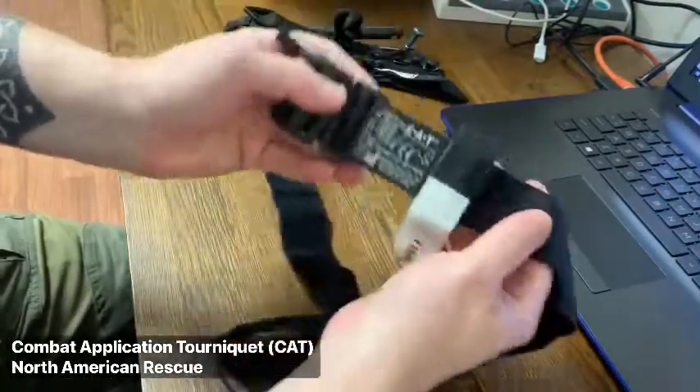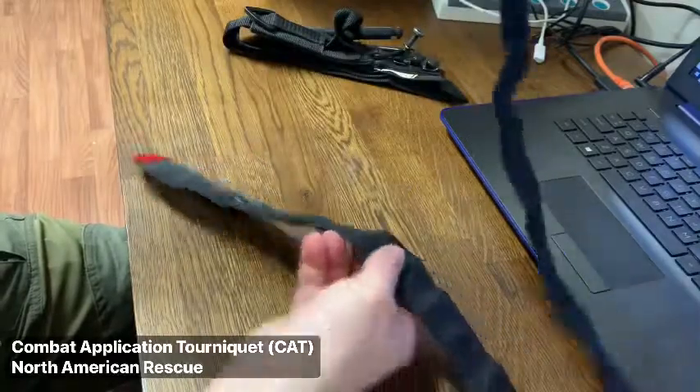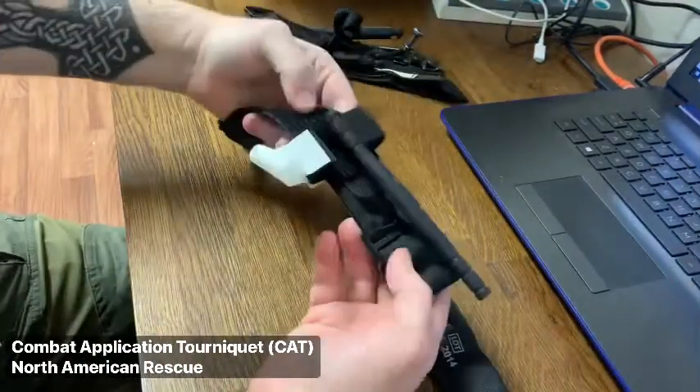First, we have the Combat Application Tourniquet produced by North American Rescue. This is an older generation than the one currently available, but still functions in a similar fashion.